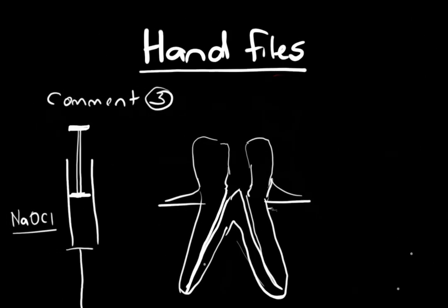Once the dentist has cut their access cavity, make sure they always start to irrigate with sodium hypochlorite, tons and tons and tons. So that's the irrigation needle there, and really flood the whole chamber, and then suction it out. So suction, and then again and again, because when you're cutting the access cavity, there are chips of dentine and chips of amalgam and chips of whatever you're drilling, and that can obviously fall down the canal and block up the canal.